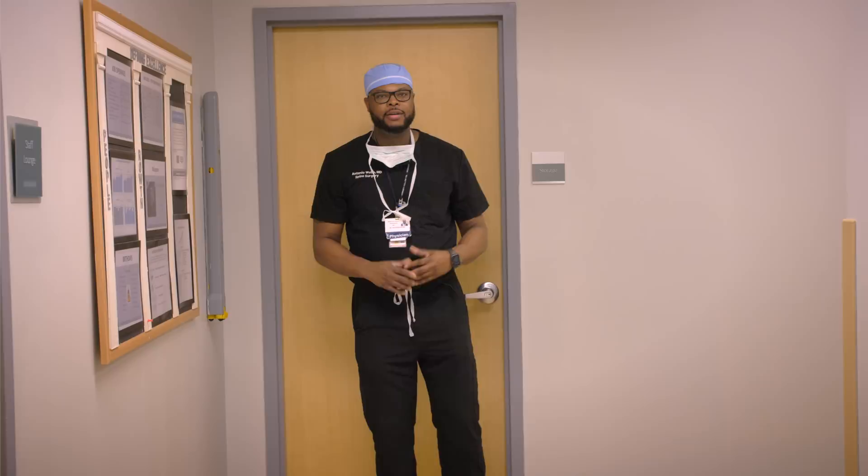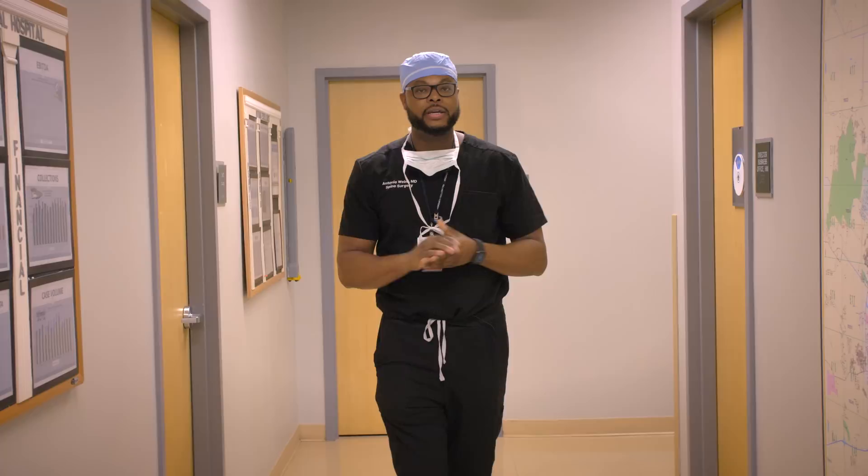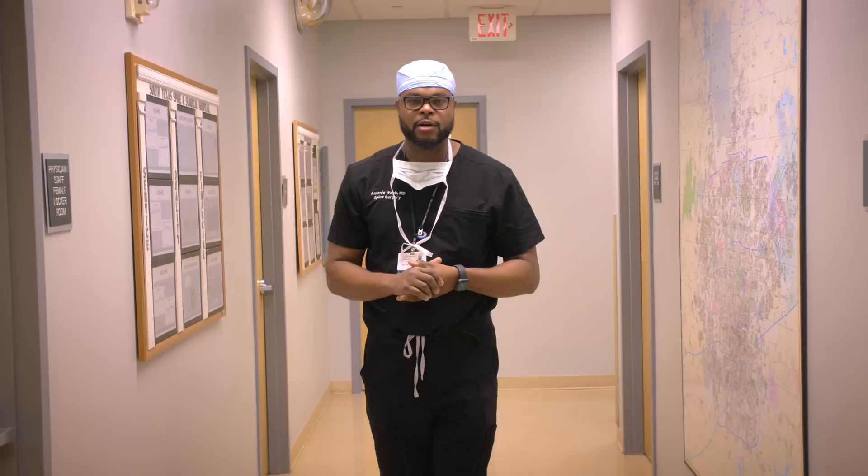Hi, my name is Dr. Antonio Webb. I'm an orthopedic spine surgeon here in San Antonio, Texas. Today we're going to be doing a lumbar laminectomy with posterior instrumentation. This is for a gentleman who I've been a physician for, who's had problems with his back and his leg for a long time now. We're about to get started.